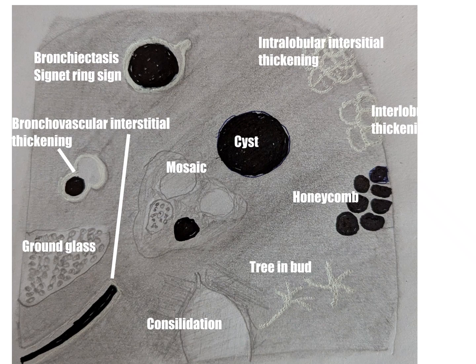And when you have these white lines crisscrossing the secondary lobular structure, it means that there is interstitial thickening or interstitial fibrosis. Similarly, in honeycombing you have low density areas, and similarly in cysts also you have low density areas.